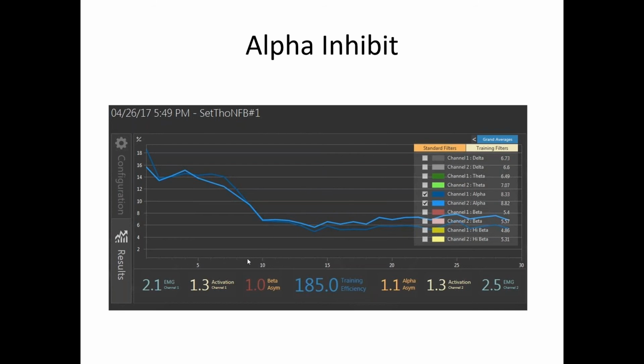So we see that pattern, but what I tell people is this is also a general pattern. If this was instead of minute 1 to minute 30, this could be session 1 to session 30, because overall it's like the brain and like the universe, it's holographic in nature. It's a nested system. So in one session, you're seeing a general pattern of what the other sessions are going to look like. You break a holographic plate that's got a picture of an apple, and you've got 1,000 little apples on broken pieces. The brain is actually holographic, and it takes two-dimensional space-time and turns it into a three-dimensional holographic perceptual experience. That's the physics.